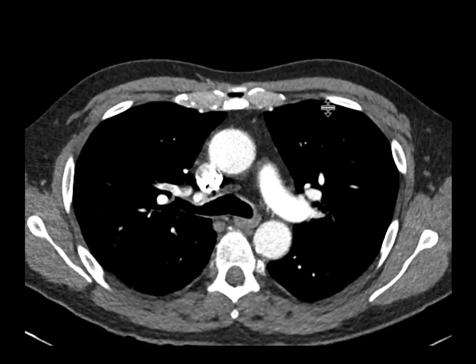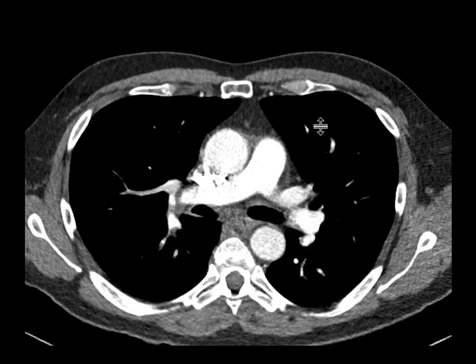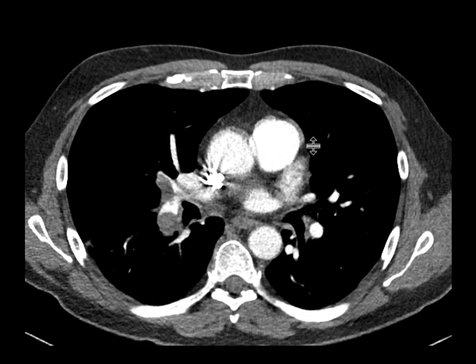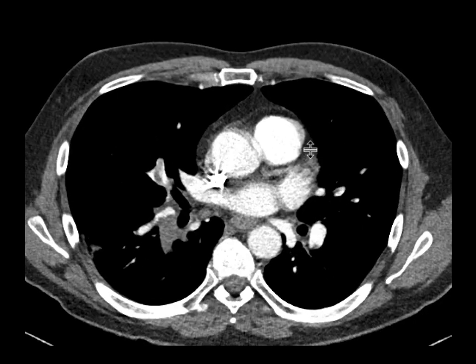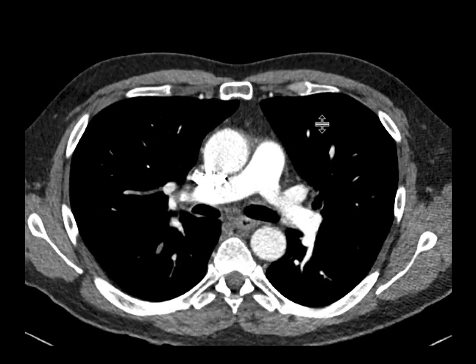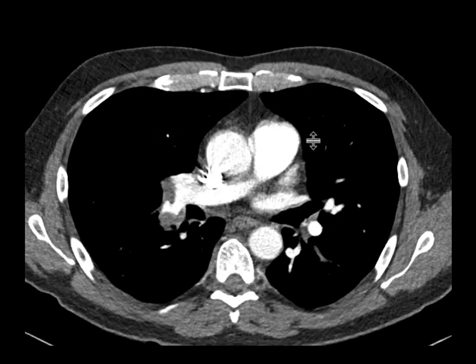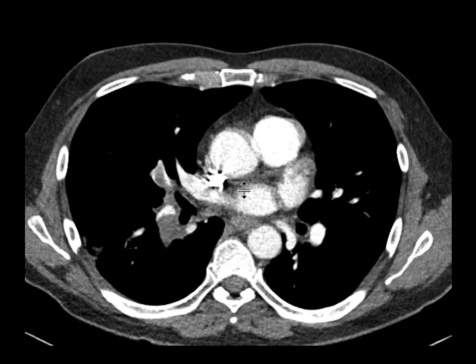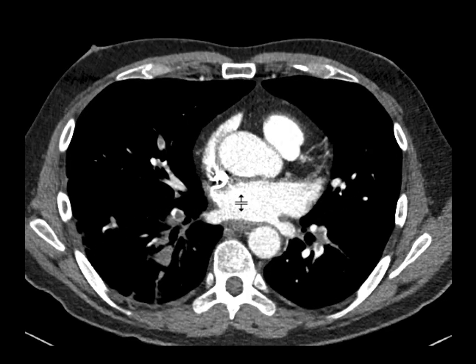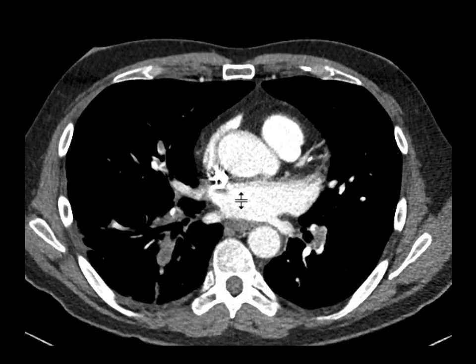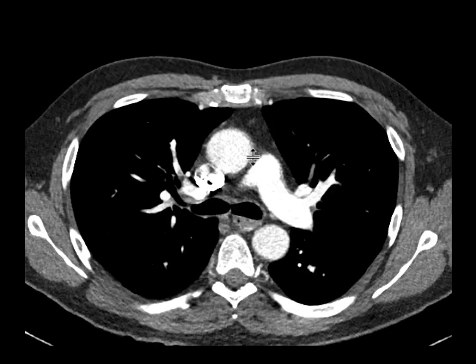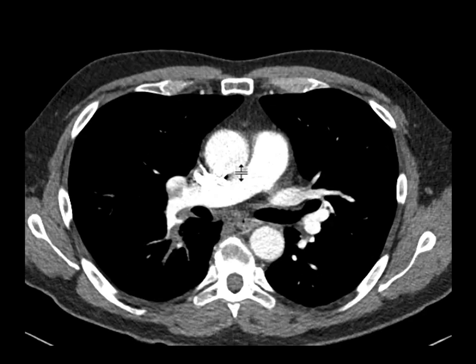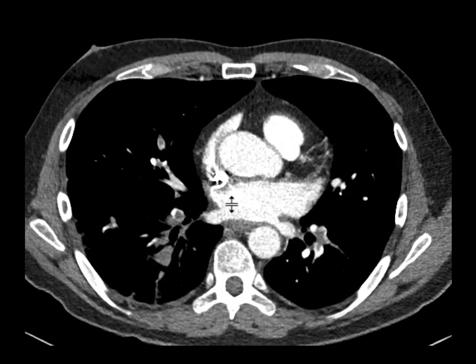We can see almost immediately that there are multifocal filling defects in the pulmonary artery — certainly the right pulmonary artery, the left pulmonary artery, the lobar and segmental subsegmental branches — so really extensive pulmonary emboli in this patient.